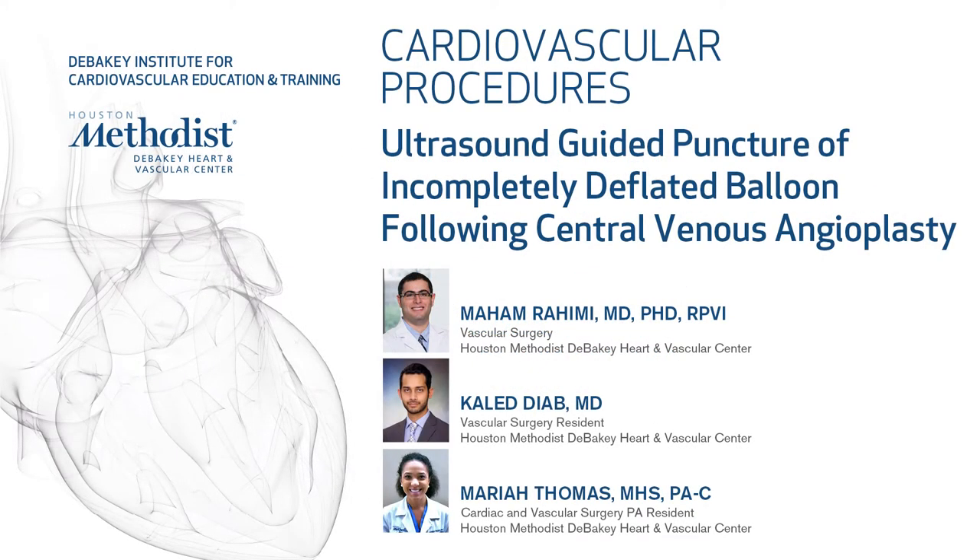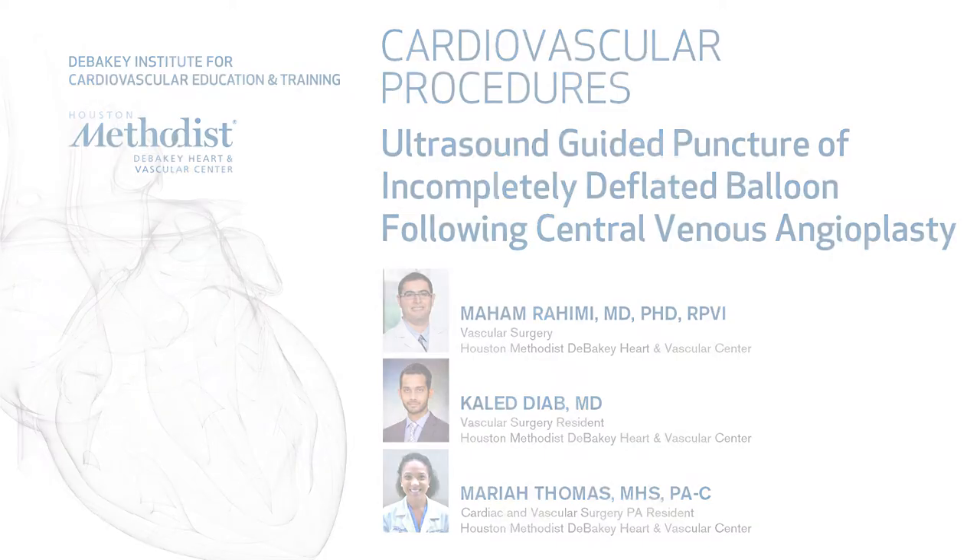This video demonstrates an ultrasound-guided puncture of an incompletely deflated balloon following central venous angioplasty for a subclavian in-stent stenosis in a patient who presented with gradually worsening right upper extremity swelling.